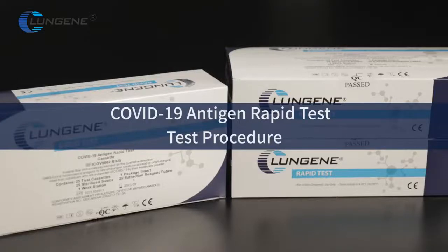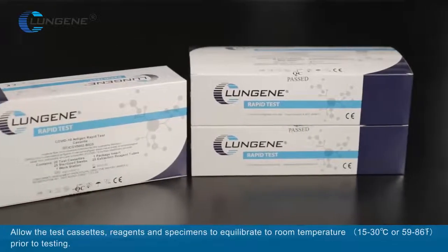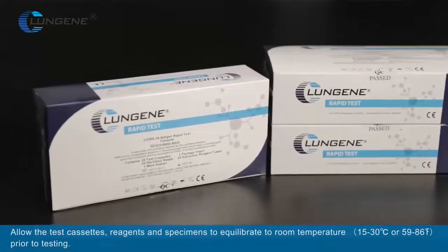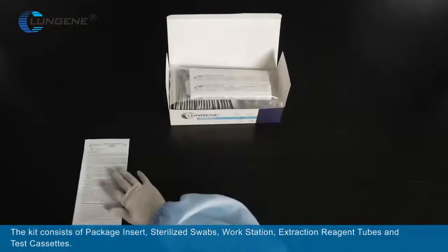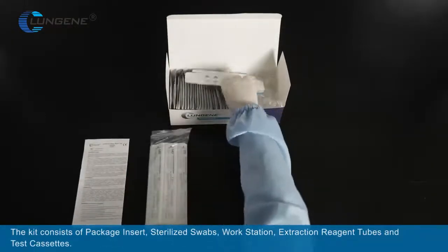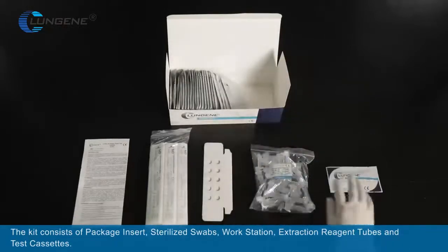COVID-19 antigen rapid test procedure. Allow the test devices, reagents, and specimens to equilibrate to room temperature prior to testing. The kit consists of package insert, sterilized swabs, workstation, extraction reagent tubes, and test cassettes.